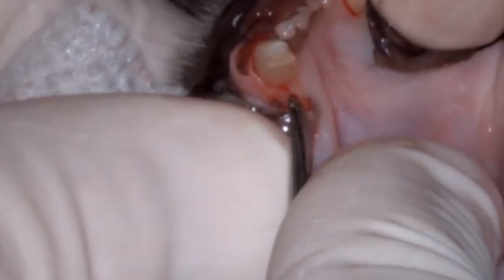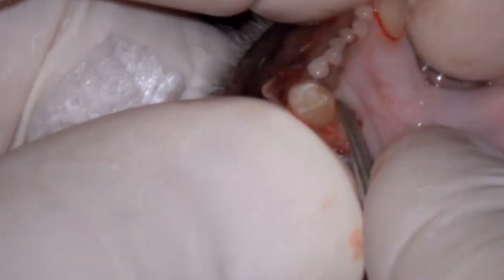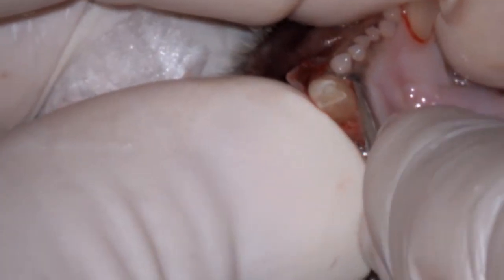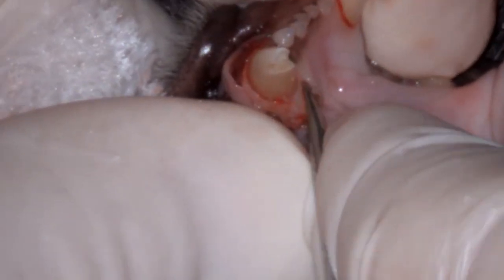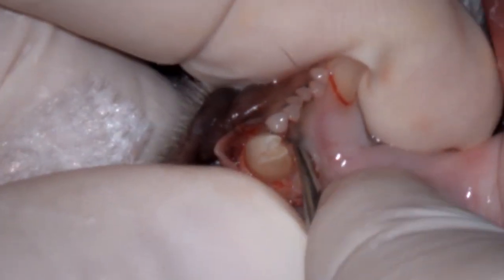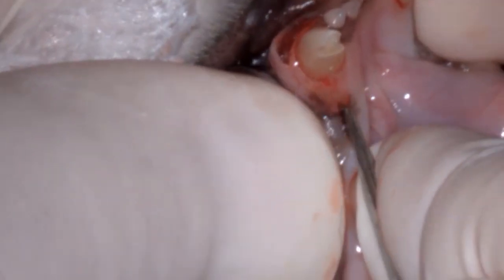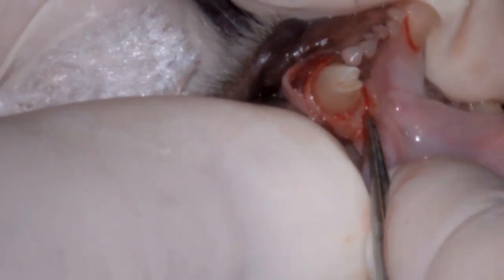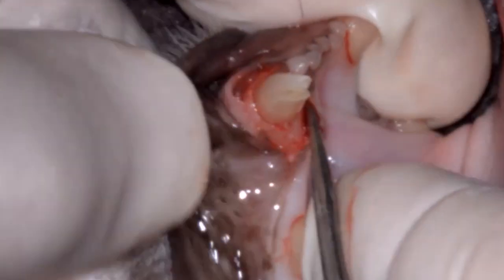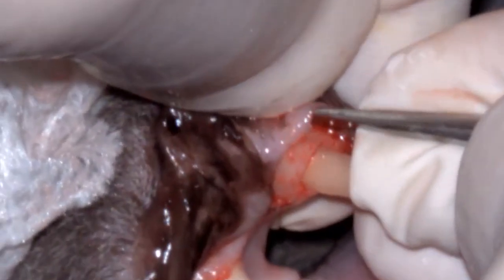Now I want to get the gingiva away from the canine tooth, while trying to preserve the gingiva around the third incisor because my hope was to leave that in place. I'm elevating the gingiva and soft tissue away from the bone on the lingual aspect of the tooth in order to gain access to the bone there and work around the tooth's entire circumference. I'm now just about satisfied with my flap, removing just a little bit more of the muscle from the bone before we start bulk bone removal.